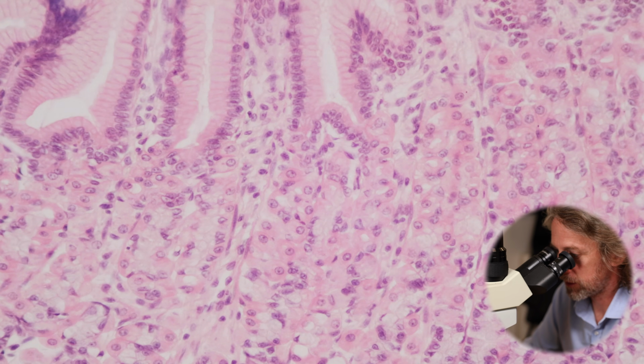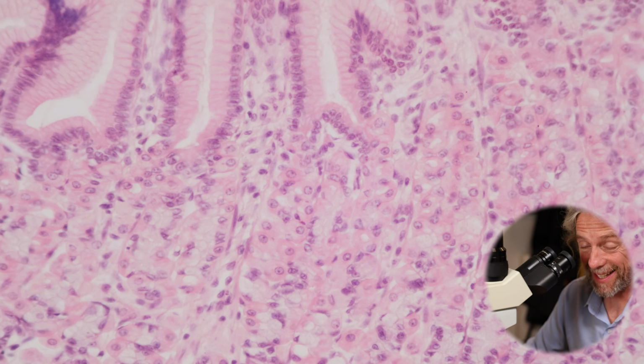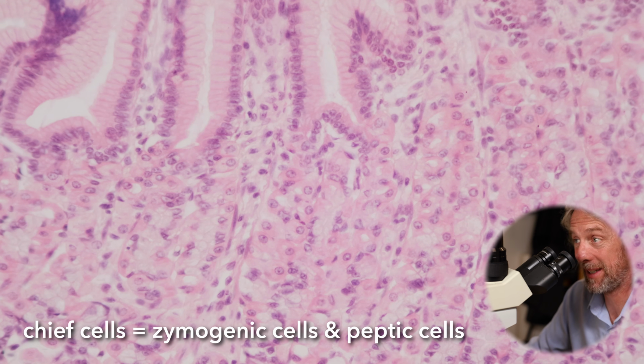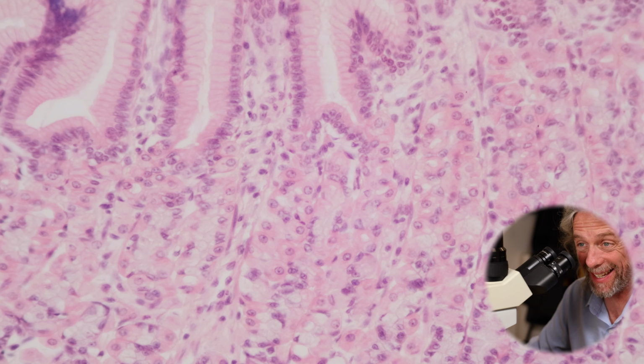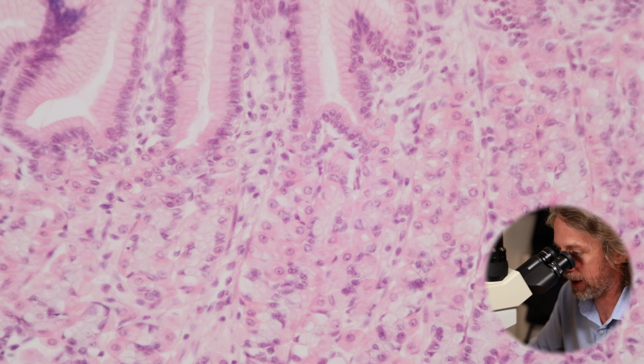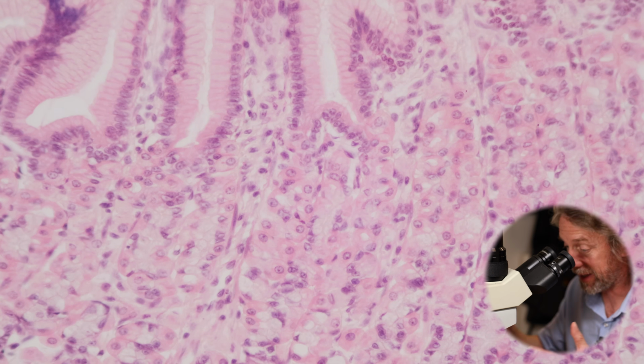The chief cells are also called zymogenic cells. Zymogen, that relates to the proteinase bit. They're also called peptic cells. And chief cells also produce gastric lipase. So a lipase would digest fats. I don't think it does a huge amount of work, but it's in there. And that's what we're seeing here.